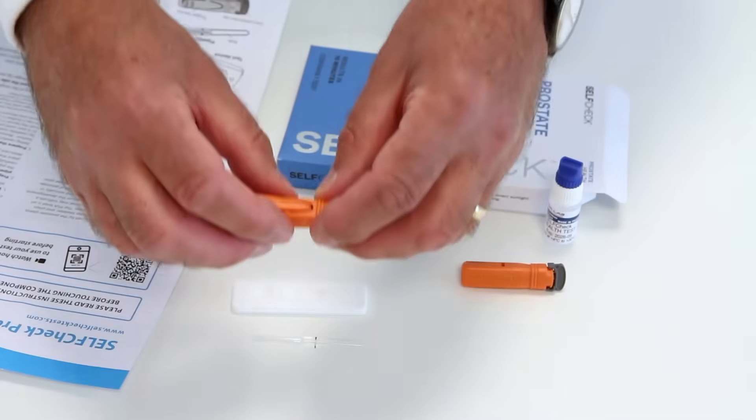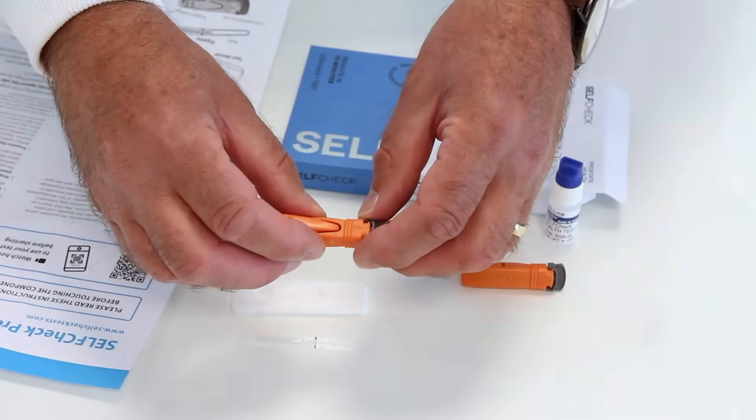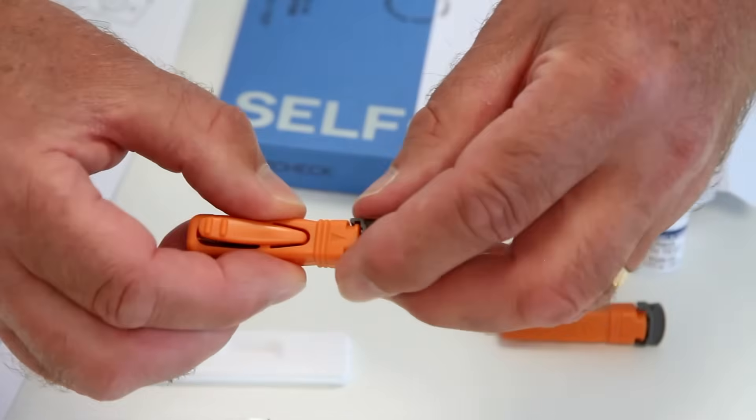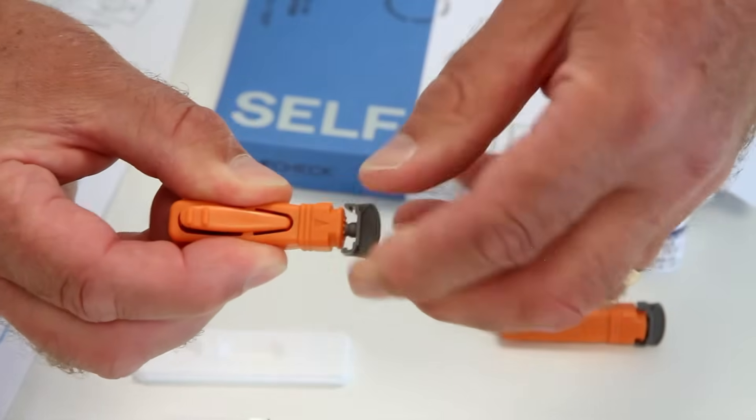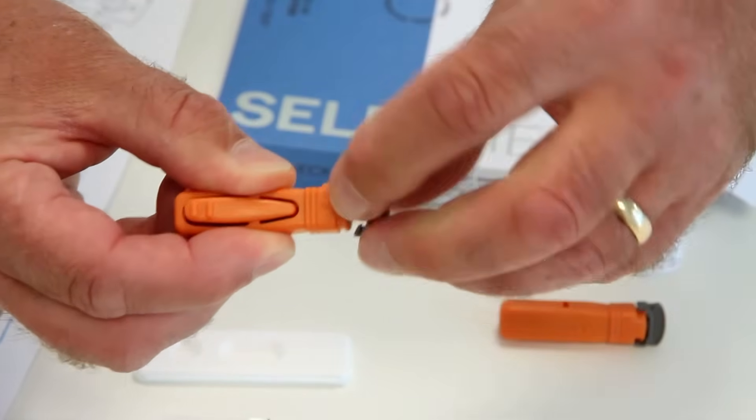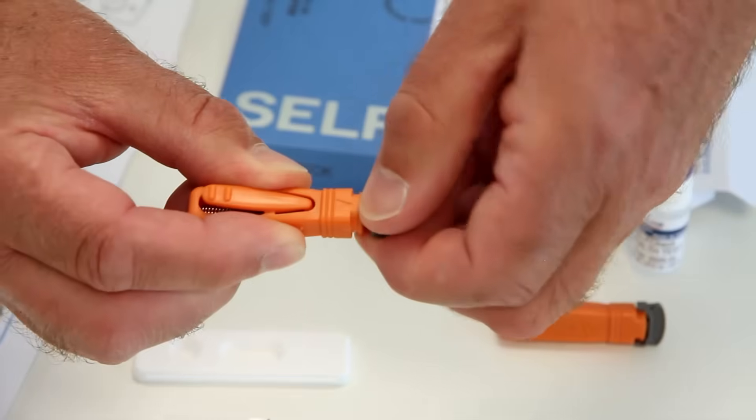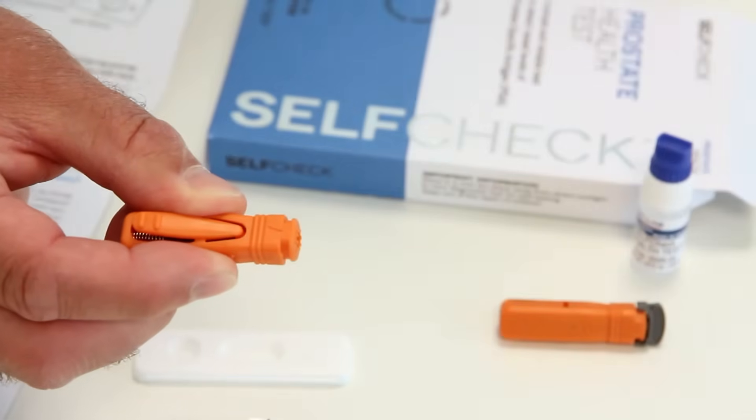Pick up one of the lancets, taking care not to touch the trigger button. Twist the cap three to four turns, then pull off the cap. You won't see the small needle as this is hidden within the lancet. Discard the grey cap.